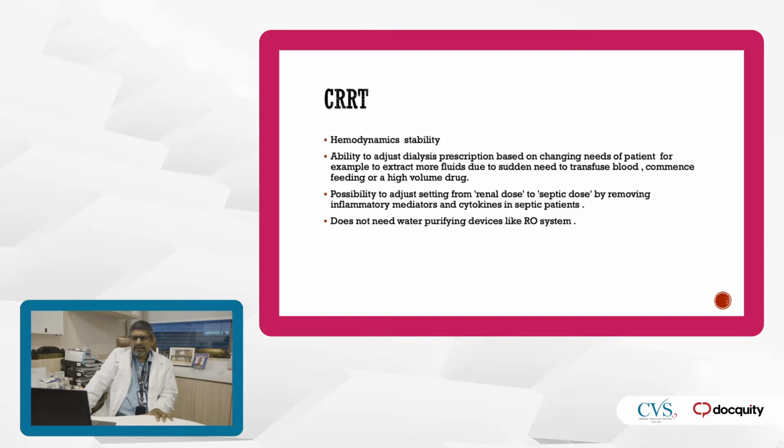In addition, we often use CRRT from a renal dose to a septic dose. There is some evidence that taking out higher amounts of solutes can remove inflammatory mediators and therefore may play a role in reducing systemic inflammatory reactions. In addition, CRRTs do not need any water purifying system because we use standalone bags for the fluids.